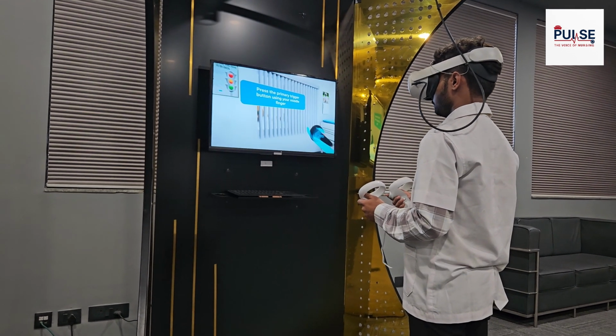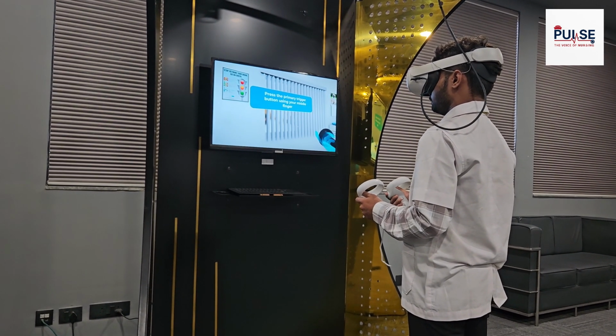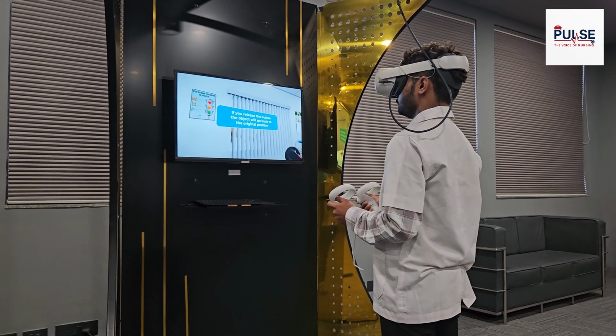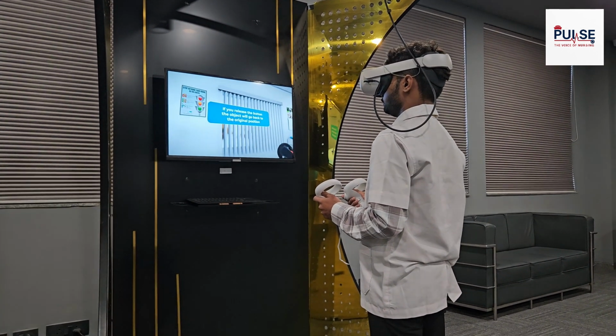Press the primary trigger button using your middle finger. This button allows you to pick up any object. If you release the button, the object will go back to the original position.